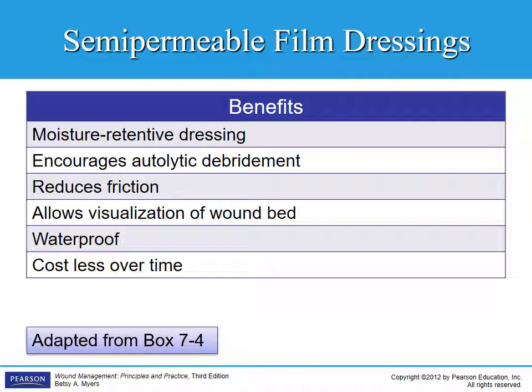The benefits are that it is moisture retentive, encourages autolytic debridement, and reduces friction. You can actually see through a semi-permeable film, so you can see what the wound bed looks like. It's waterproof, and it costs less over time because, remember, you're not changing it as frequently.